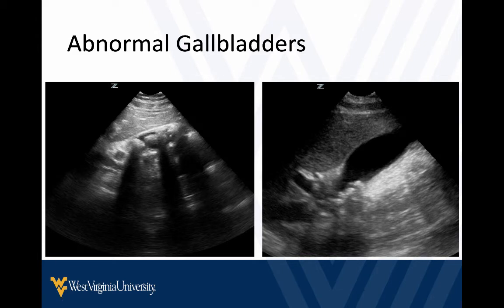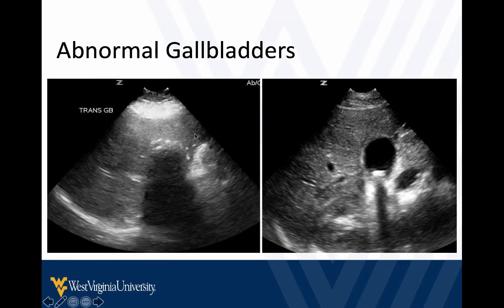Obviously, we'll fan through there to be sure, but try to recognize gallbladder and portal vein every single time. Other examples, so here we can see the liver parenchyma, and we're right in the area where we think the gallbladder should be. It's a little bit difficult to see because it's full of stones. The stones go all the way up to the edge of the wall, and we see just a big dark shadow right in the expected area of the gallbladder.